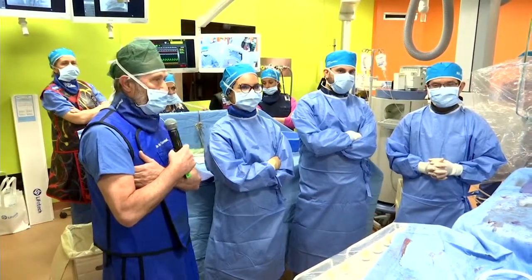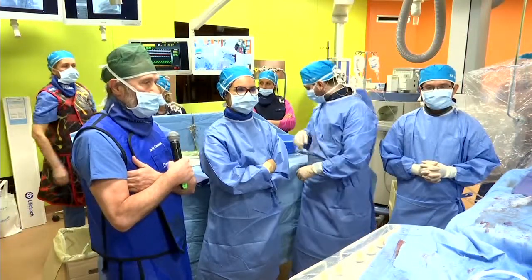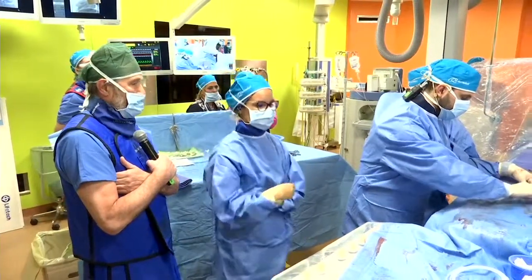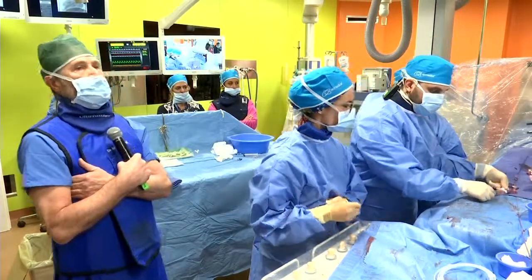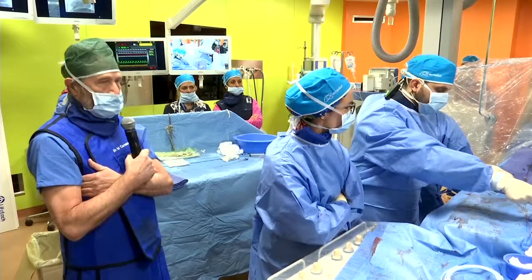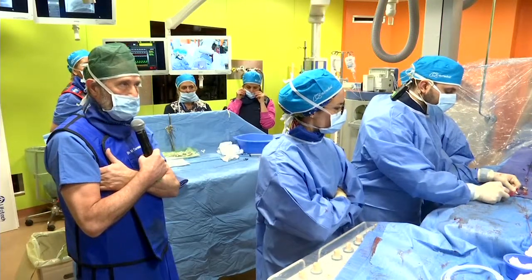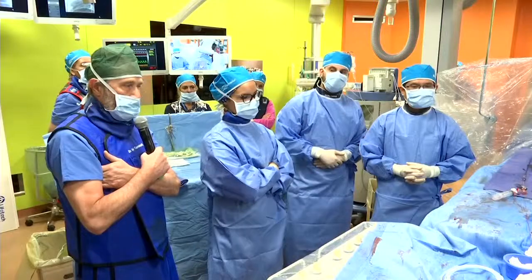Zahia Saliba from Beirut. I have one case, one late appearance of complete AV block with ADO1. Eighteen months later, the patient came with AV block, and we put in a pacemaker. It was initially oversized, I think. I put in 8/6 instead of 6/4. With this anatomy, the device was squeezed in the VSD, and later the device took its initial shape. So I think the tension was the cause of AV block.